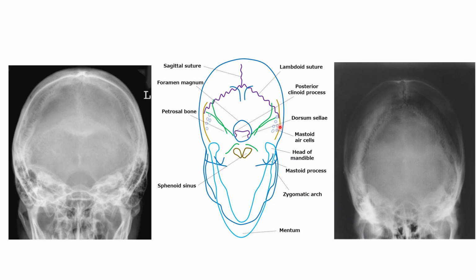This image is done as an AP projection so that the occipital bone will lie on the table or up against the upright bucky as close to the IR as we can get it. The angulation will be caudal, 30 degrees to the OML, if the patient is able to flex their chin enough to place the OML perpendicular to the IR. If they are not able to flex their chin enough to place the OML perpendicular, we can use the IOML perpendicular to the IR and angle 37 degrees caudal to the IOML.